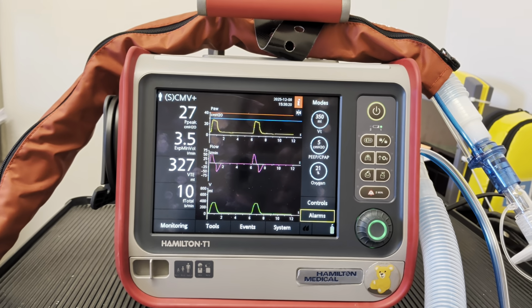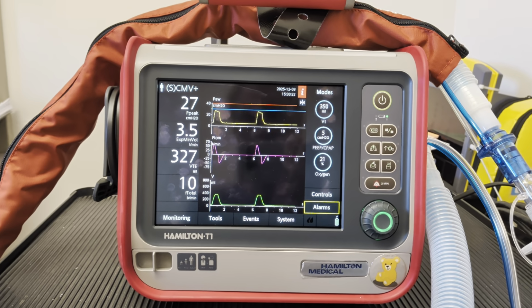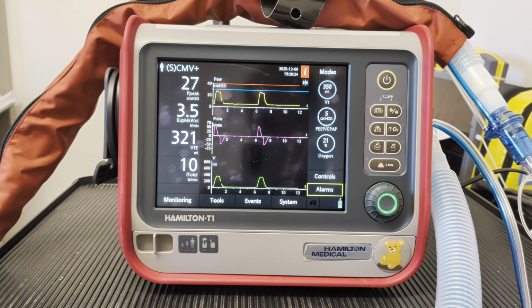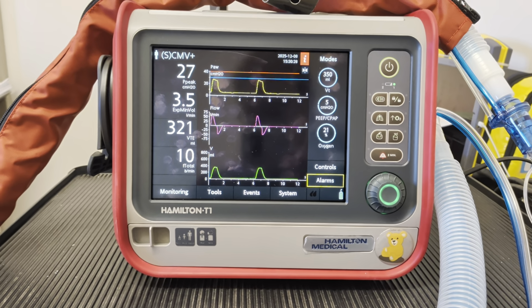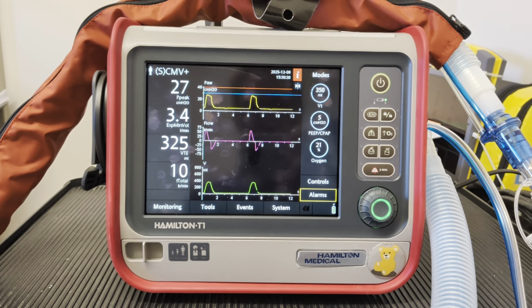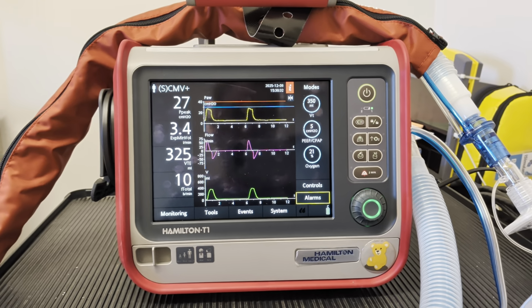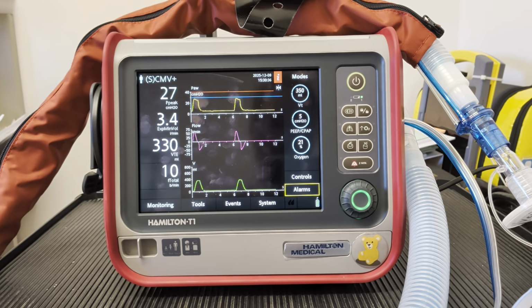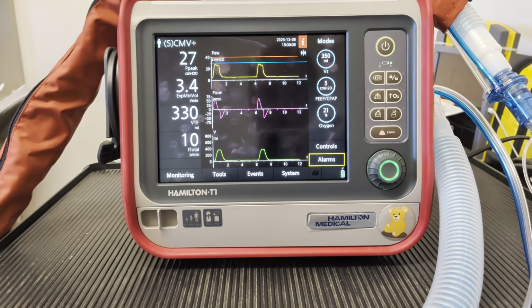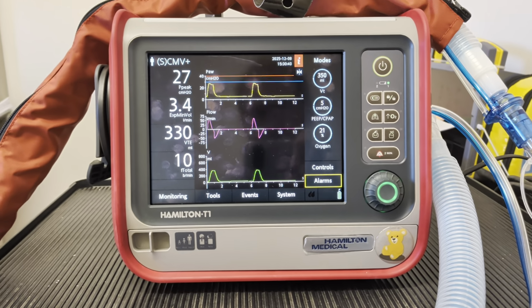Okay, so with that caveat out of the way, I want to talk about some of the common issues that we run into. The three categories of common issues are, first, patient comfort or synchrony with the ventilator. The second category is difficulty oxygenating, right?